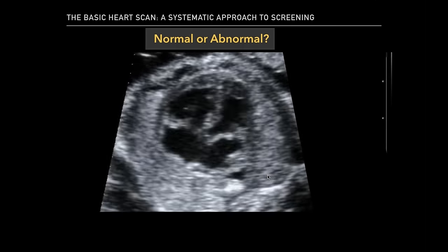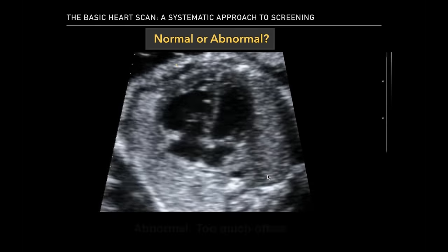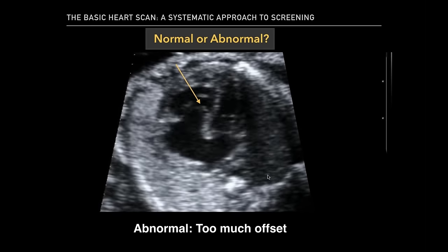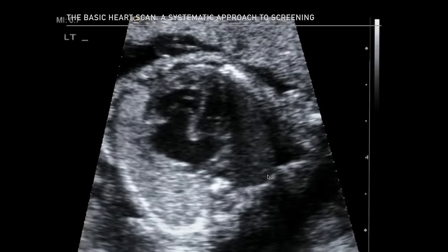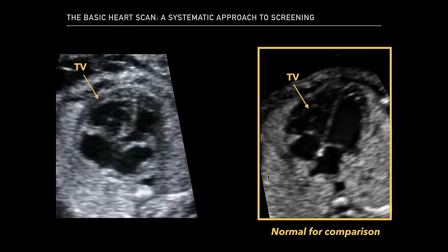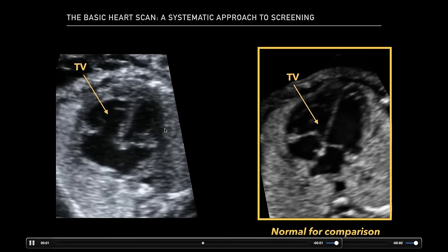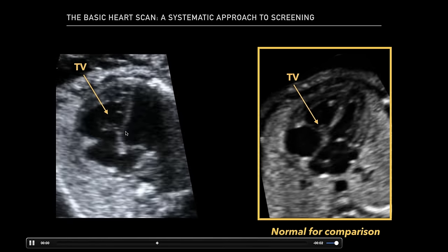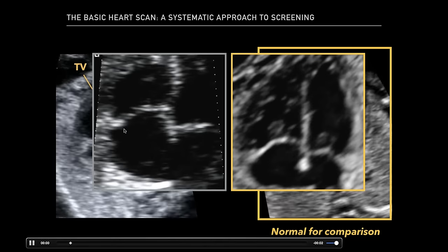Now, in this clip, is this normal or abnormal? Here we do see an offset, but I think this offset is too much. So clearly this is abnormal. In comparison with the normal four chamber, here we see the tricuspid valve with a normal offset. But in this case, we have the tricuspid valve closer to the apex of the heart. It's more of an exaggerated offset. But let's go ahead and get a closer look.